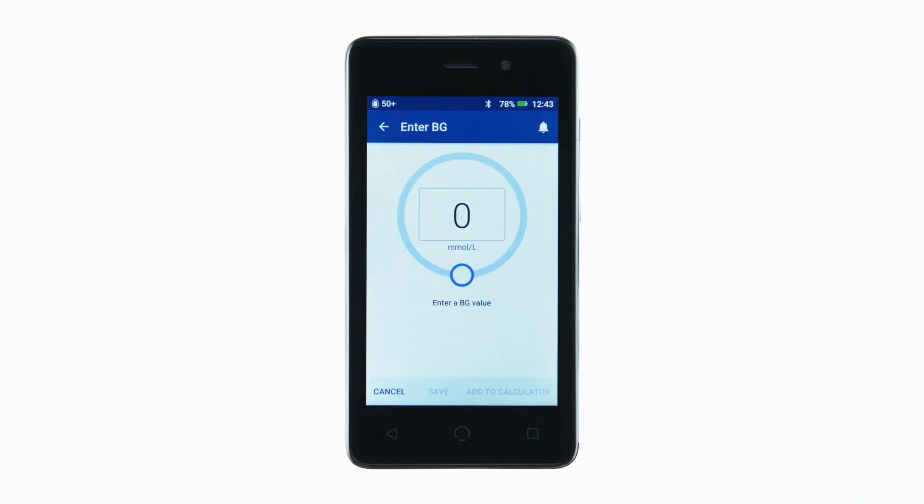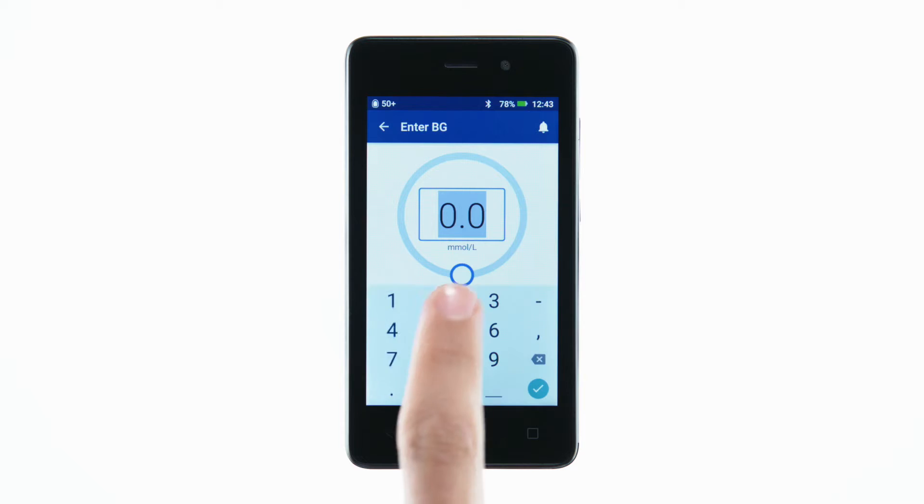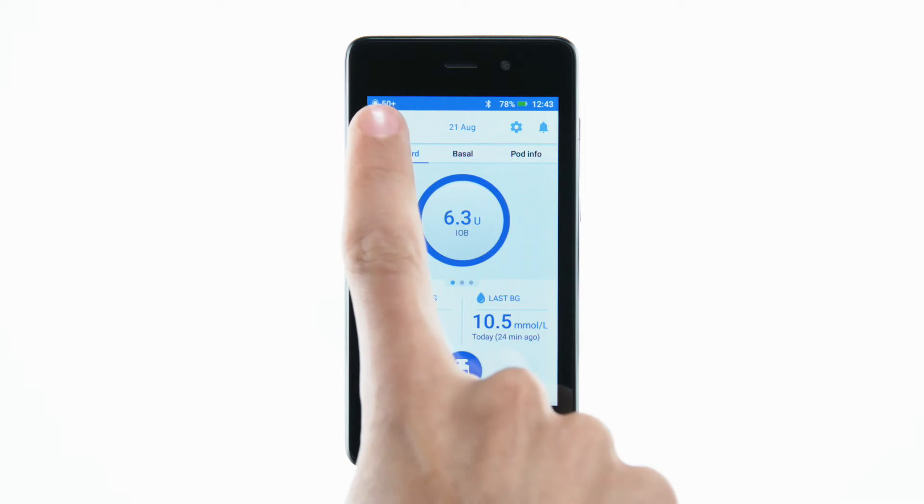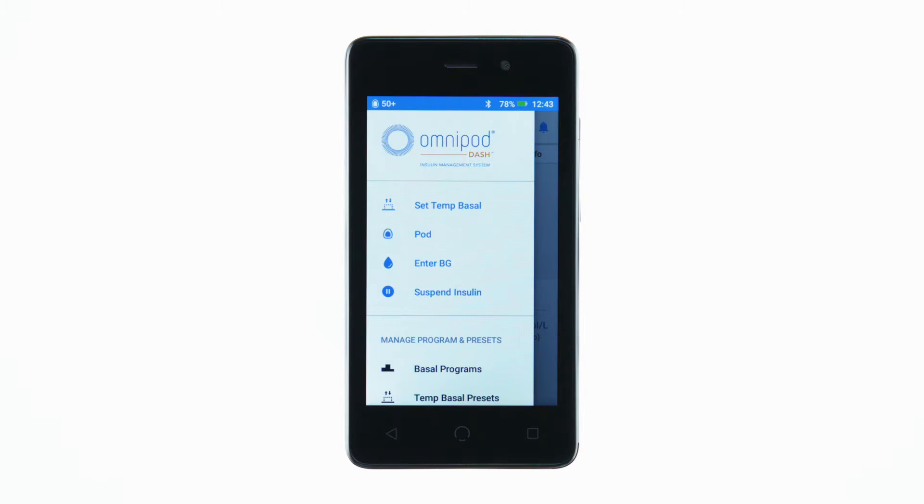To check your blood glucose value, enter the reading from your BG meter manually into the Omnipod PDM. You can do this as often as you like. It's important to check your blood glucose values regularly throughout the day.